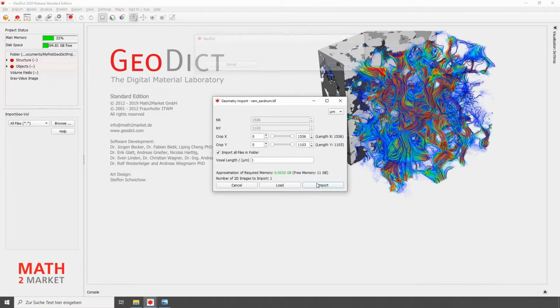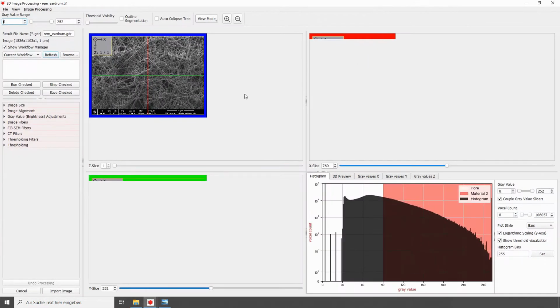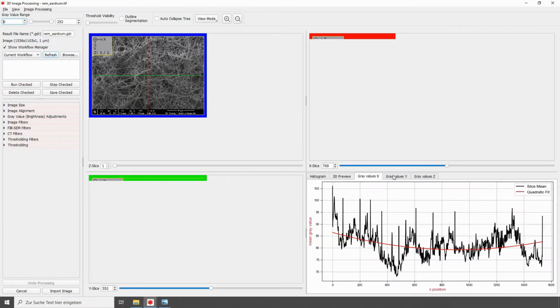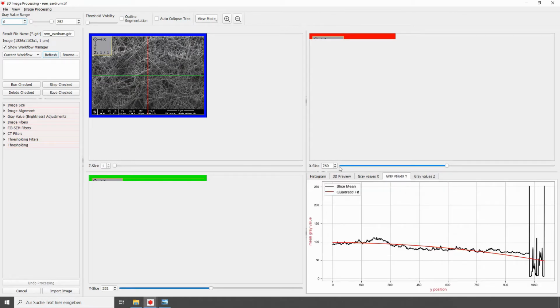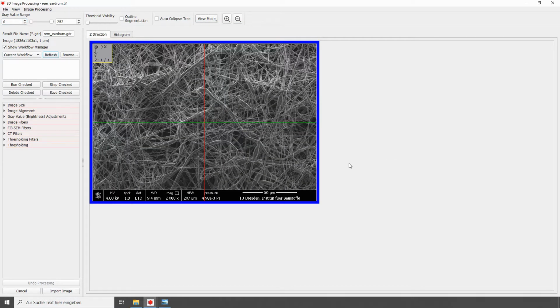After we click on Import, the Import GeoVol main window opens, where we can edit and modify the SEM image. Our final goal is to segment the image and then determine the orientation of the fibers. We will first switch to the Stacked View mode under View mode. Since this image is a 2D image, we look from the Z-axis in the direction X and Y, since only these two axes contain image information.